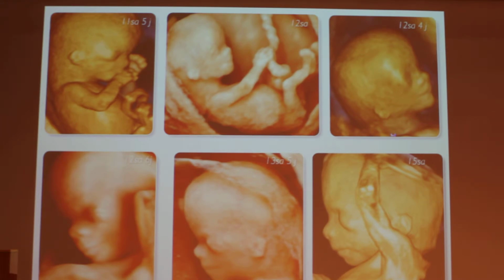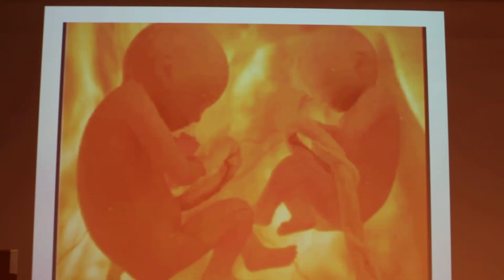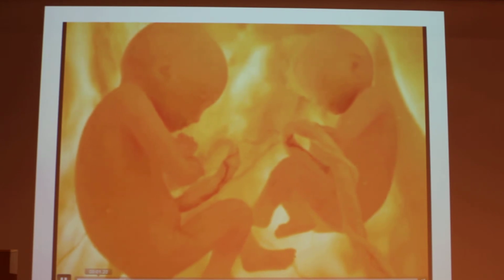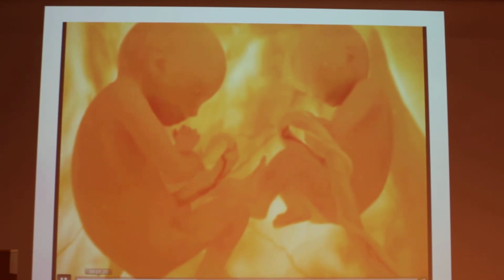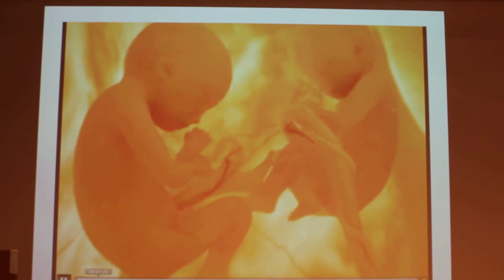These are very nice images of 3D ultrasound. And sometimes it's difficult to see what is reality and what is not. This is an amazing movie. Twins. New technologies, quite amazing.